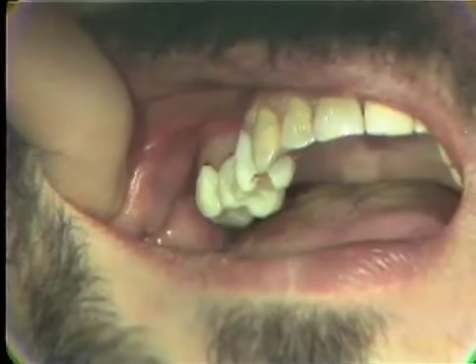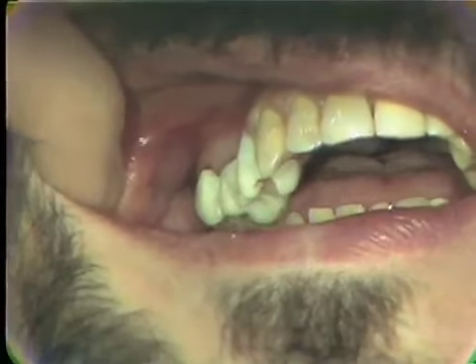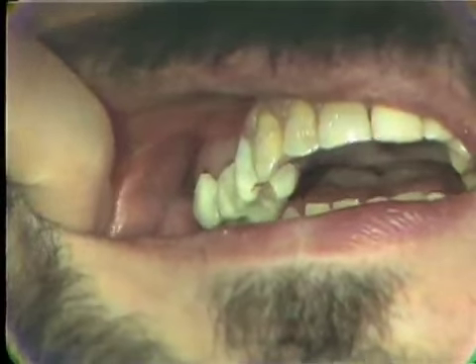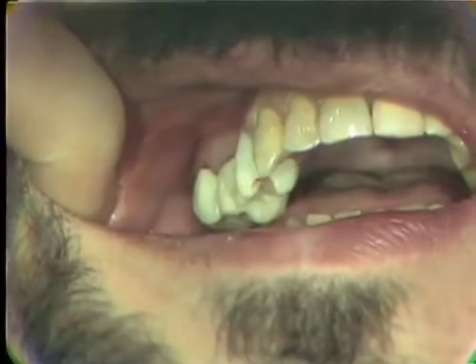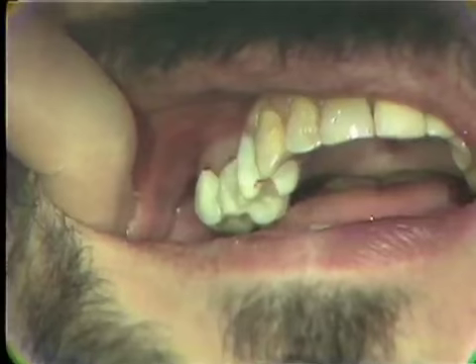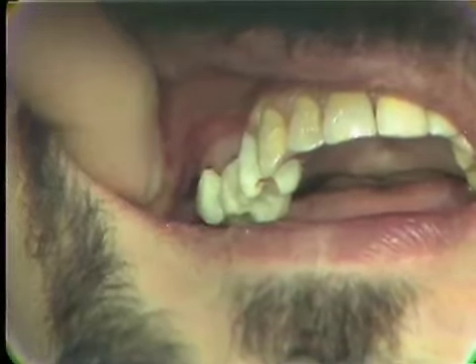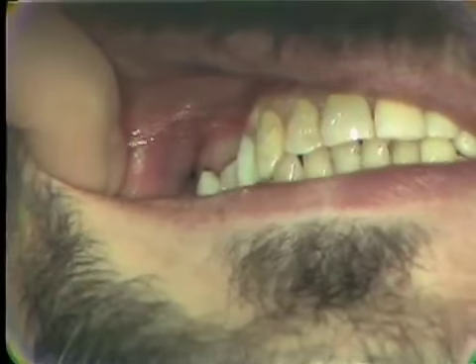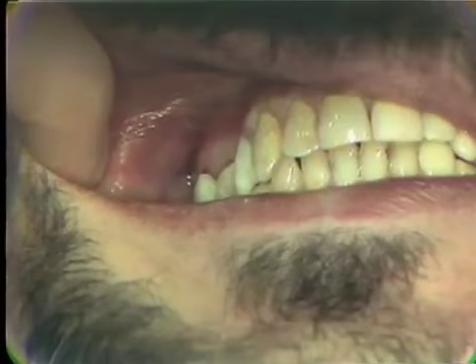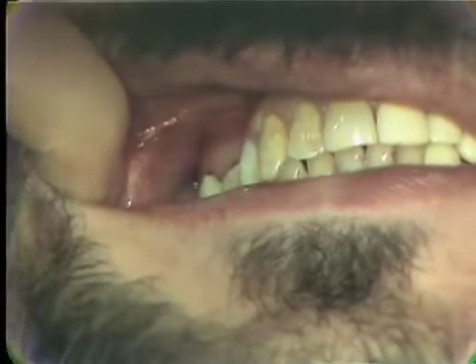Any marginal discrepancy can be corrected at this time by adding Duralay to those areas that are in error and allowing the material to set up. Again, you'd want to take the temporary out of the mouth just before it reached its final set. Close, please. Bite hard. Again, the patient opening and closing would maintain our occlusion while the material is setting.